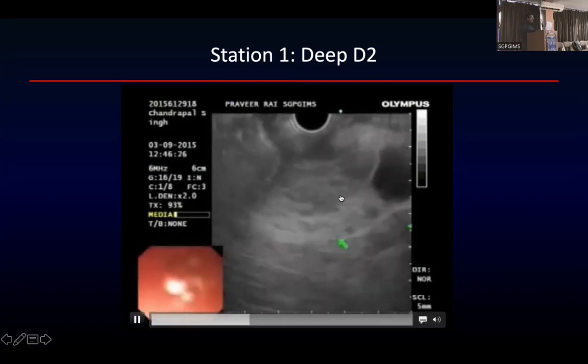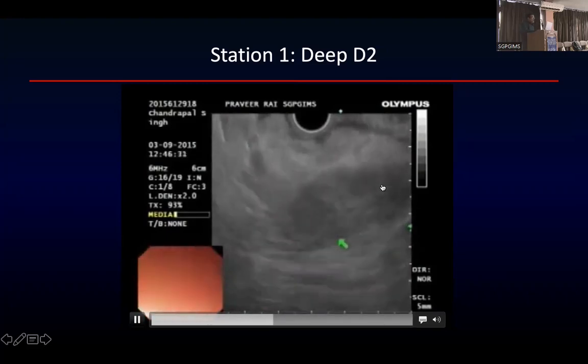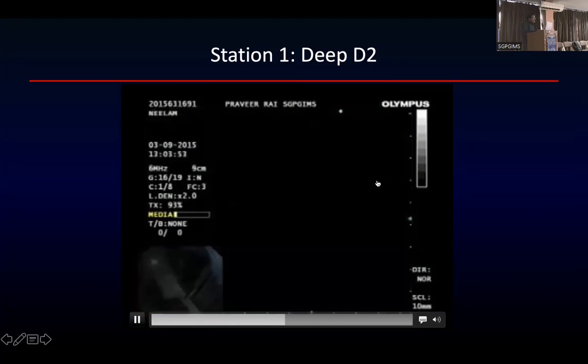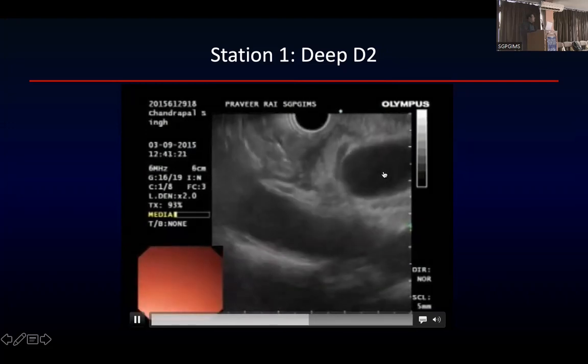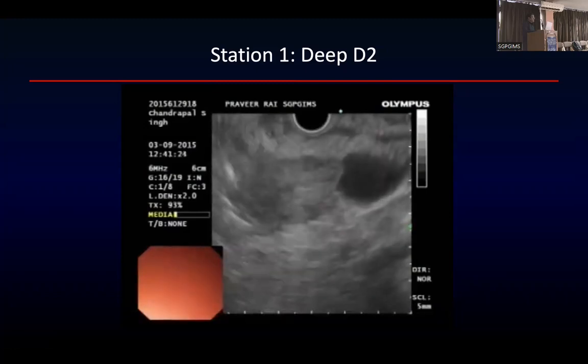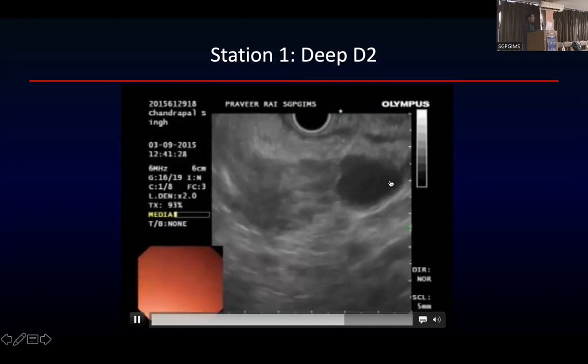ओके, ये आ गया लार्ज मास, आ गया ये लार्ज मास ऑक्यूपाइंग द अनसिनेट इन द हेड है. और फिर आपको एनीकोइक स्ट्रक्चर नजर आएगा. That anechoic structure here, this what is structure. और कुछ हो सकता है?